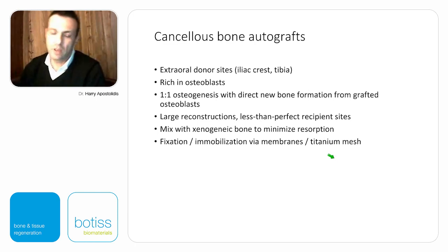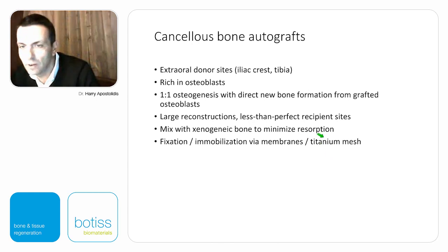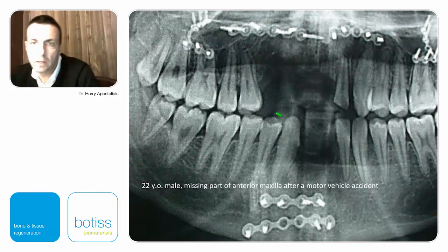Has been found to have almost 50% exposure rate in the mouth, so I don't really like using that. When I have intraoral access, I only use membranes to fixate the graft. And you're going to see a couple of cases.